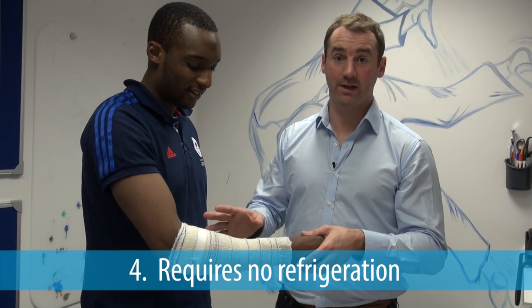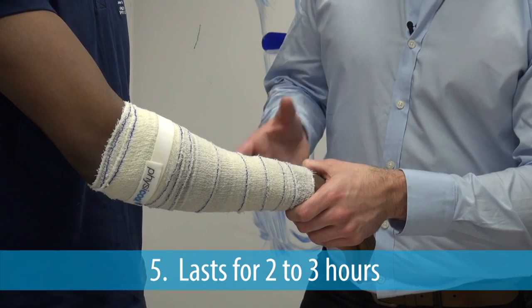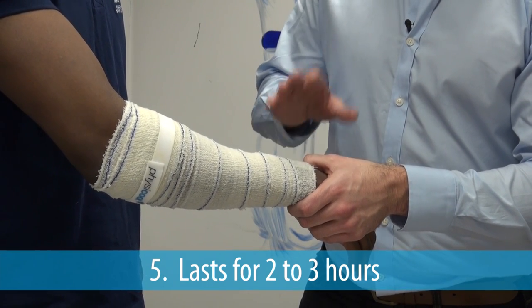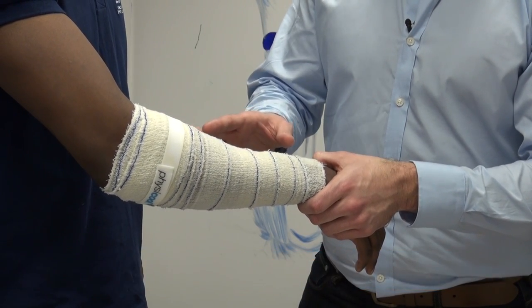Physical requires no prior refrigeration, so it can be used anywhere and at any time. The best part about the product is that each bandage will give two to three hours of cooling. Unlike ice remedies, which medics advise to use for only 10 to 15 minutes at a time so as not to cause ice burn, you can leave the bandage on for as long as needed, allowing the product to continue to treat the injury.